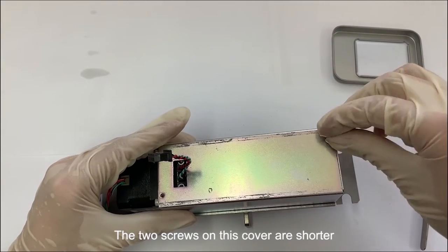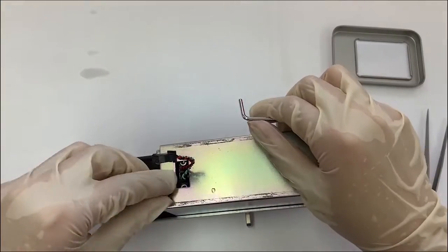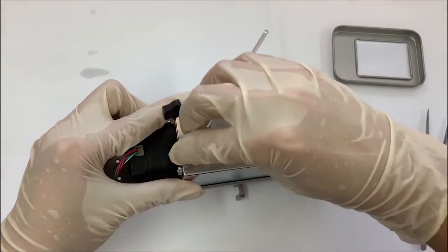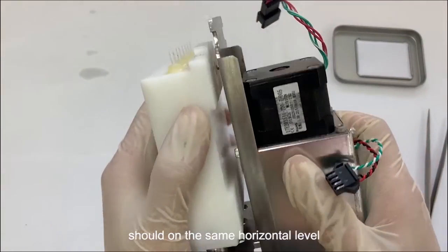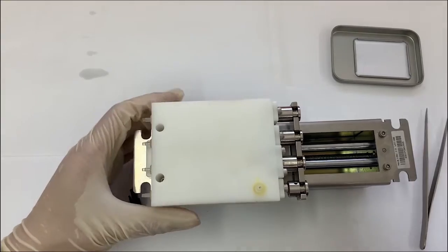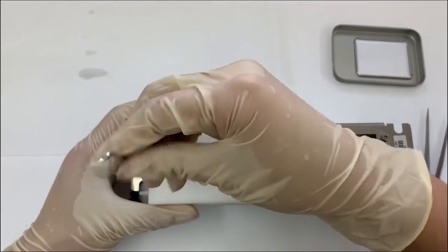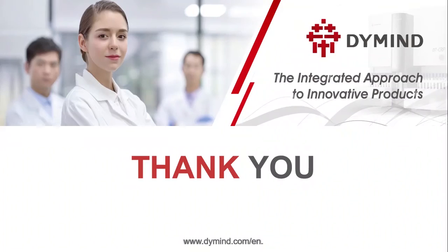The 2 screws on this cover are shorter. When you assemble the syringe, the 4 syringe pistons should be on the same horizontal level. Finally, install the 2 screws and the remaining 8 screws.